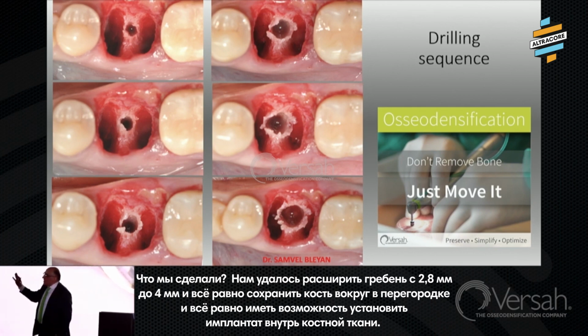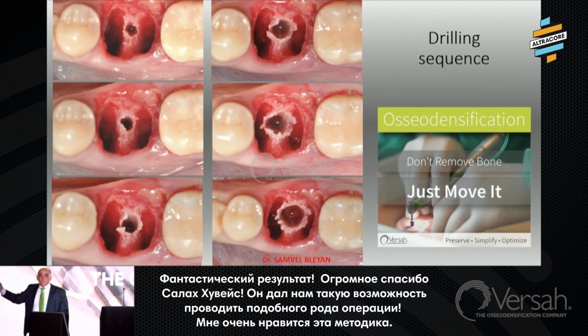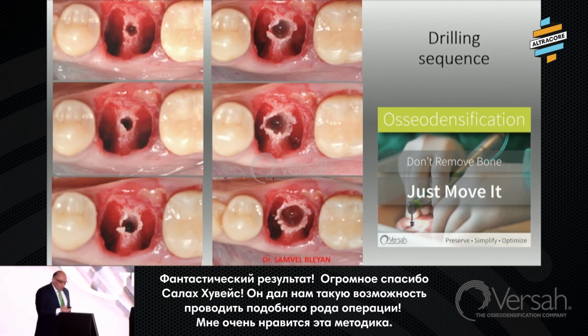Just look at this. This is amazing. Thank you very much to Salah. He just gave us this opportunity to perform such a type of procedure. I love it so much. Really, thank you so much.